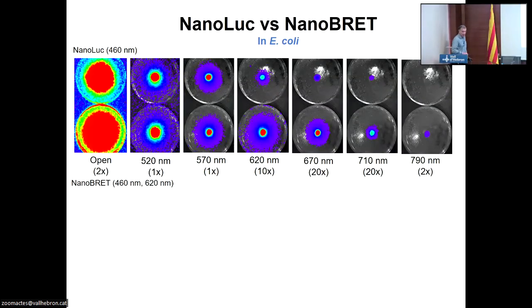And finally, what I'm going to do is show you some work that we've been doing at UCLA. This work was done at UCLA and also UC Davis as well. What we're trying to do at the moment is find ways of making NanoLuc better to use in vivo. This doesn't look very significant, but it is, because this is a construct that I designed, where if you look at just NanoLuc, this is what happens. You're taking different filters. We're imaging in the IVIS system with an open filter, and this shows all the light being produced by that particular construct.